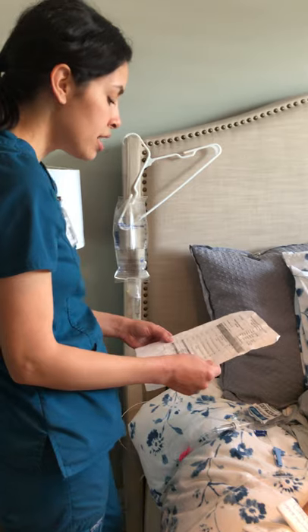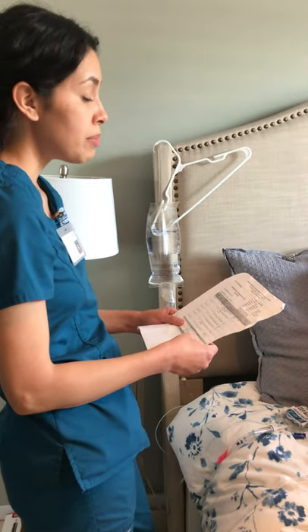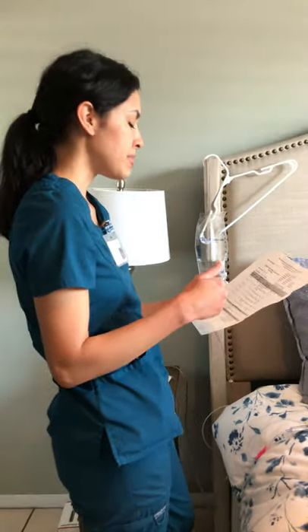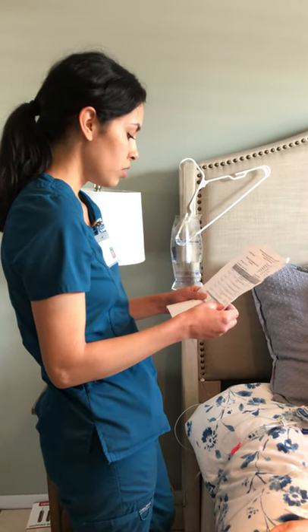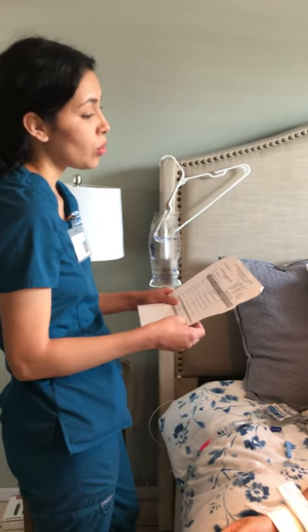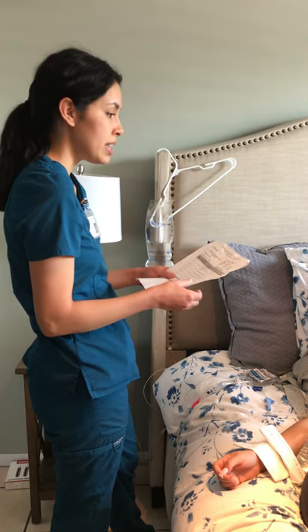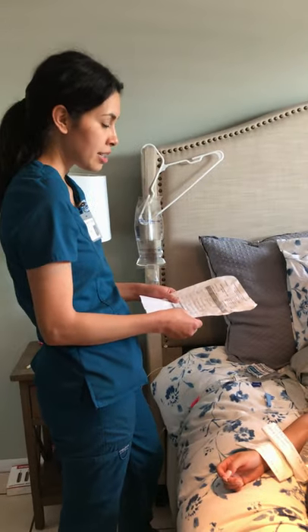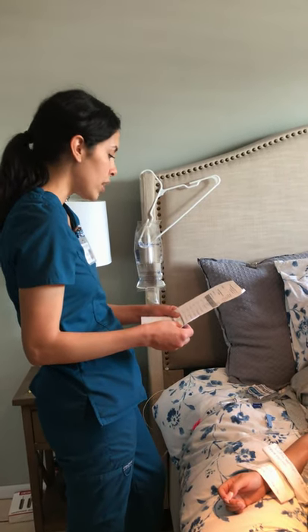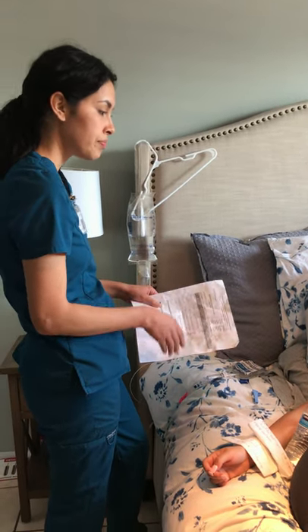What I have for you today is Cefazolin, which is an antibiotic used to treat infection. Some side effects include GI upset — upset stomach, diarrhea — and it can also cause an allergic reaction such as hives or rashes. If any of that happens, call me and let me know. Are you okay with taking this Cefazolin for the infection? Yes. I'm going to do a third check on the medication.